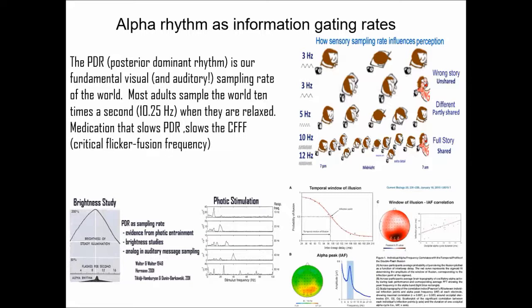This shows a little visual narrative of how, for instance, I use 10 frames for the entire night, to correspond to 10 hertz, for a person who has insomnia. You can see occasionally they're sleeping, but most of the time they're awake. Someone who's going slower gets a slightly different story. In fact, someone going very slow may get an entirely wrong story. This one is closer to the correct story about insomnia. This one is a weird story, like the person woke up in the middle of the night. This one looks like they slept right through. That's not the truth. This is the closest to the story.